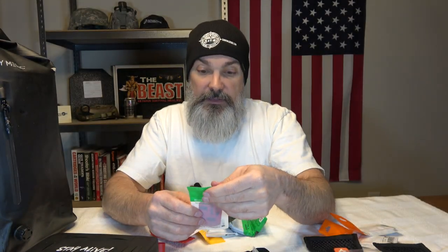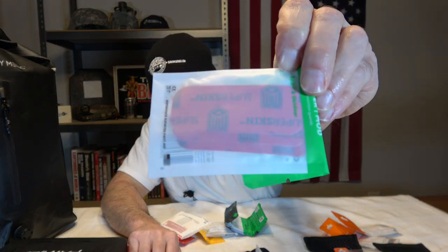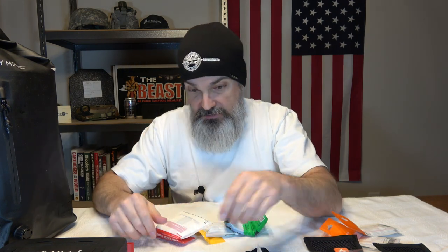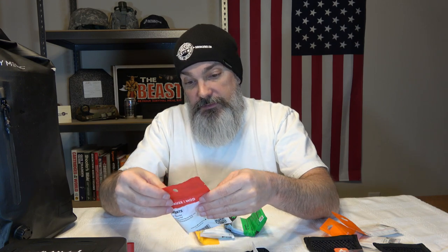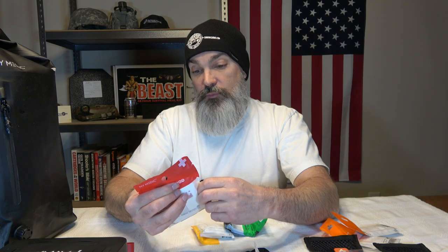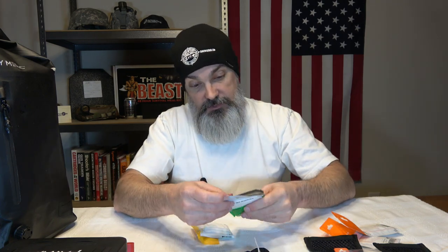Then we've got blister guards — three blister guards. These are really good if you're hiking and you start getting a blister. They're very sticky, so it holds your skin in place so you don't get that friction, and it's thick. Then we have a gauze pad for bleeding. You've got two two-by-twos, one four-by-four, two non-adherent gauze pads, and one two-inch conforming gauze roll. All this stuff seems to be from My Medic.